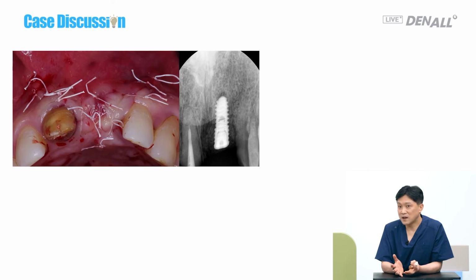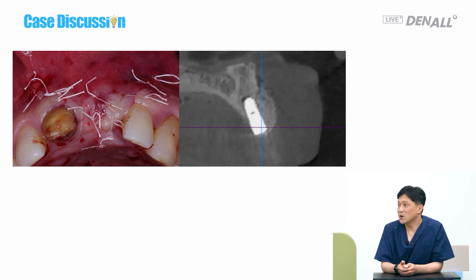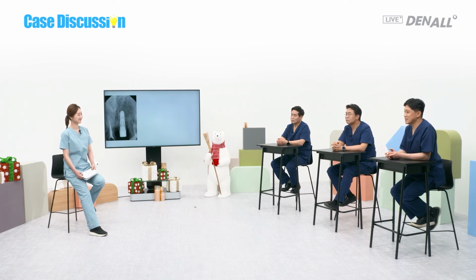Primary closure was achieved. If I had waited after this, it could have been okay, like I could get 60 marks out of 100, but I had a different idea. This is the CT. The augmentation is done properly, but I didn't like the lingual palatal part. I really wanted to do something about it, so I opened it again. I don't have pictures because I was very nervous. I take pictures, but when I'm very nervous, I cannot take pictures.